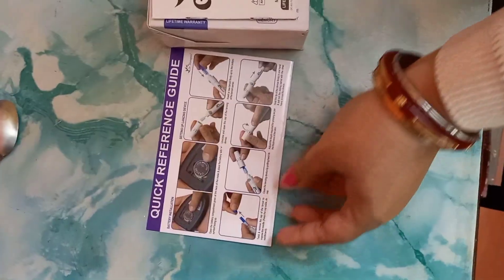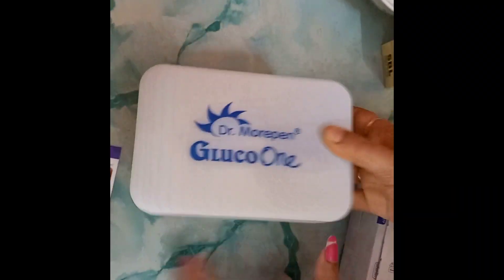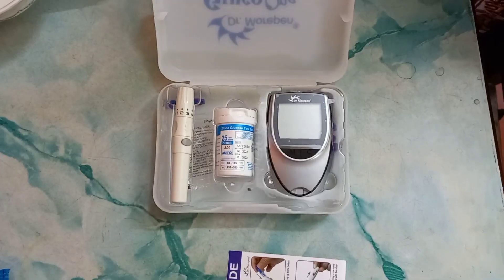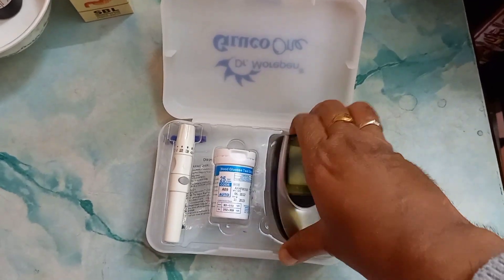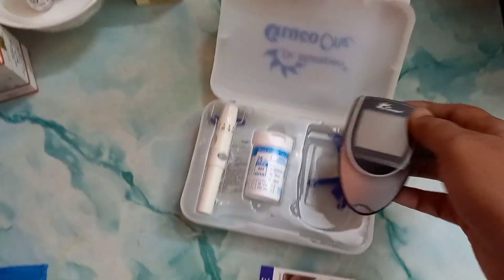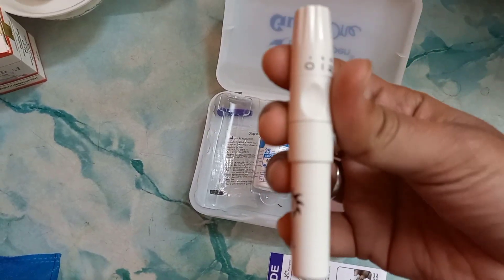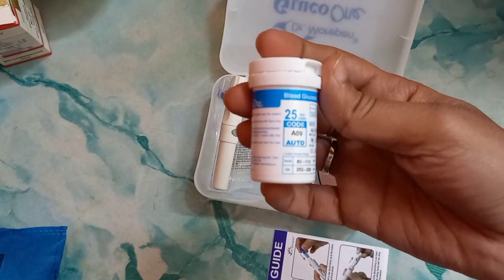This is its quick reference guide and this is its kit. It comes with three parts: this is the main monitor, this is the lancing device — the needle system which pierces the finger — and this is the container for monitoring strips.